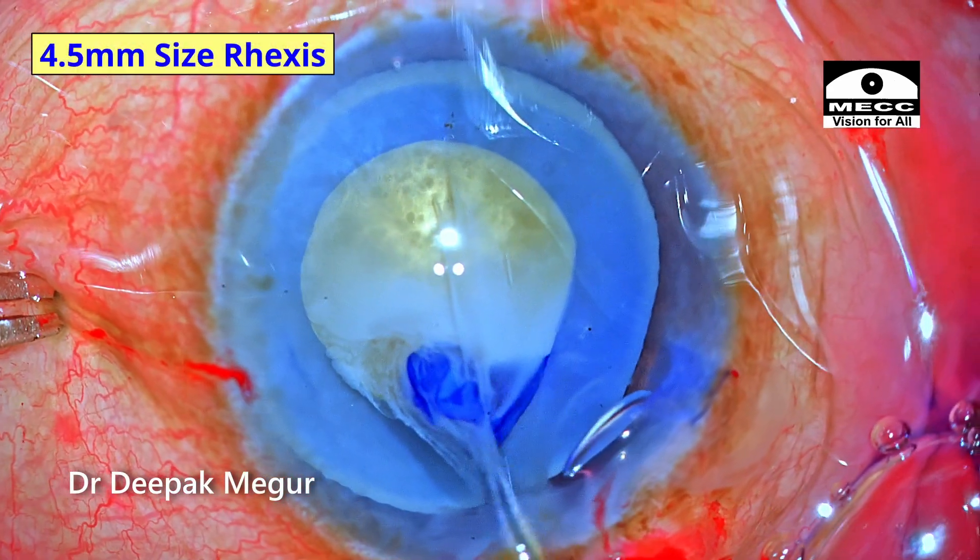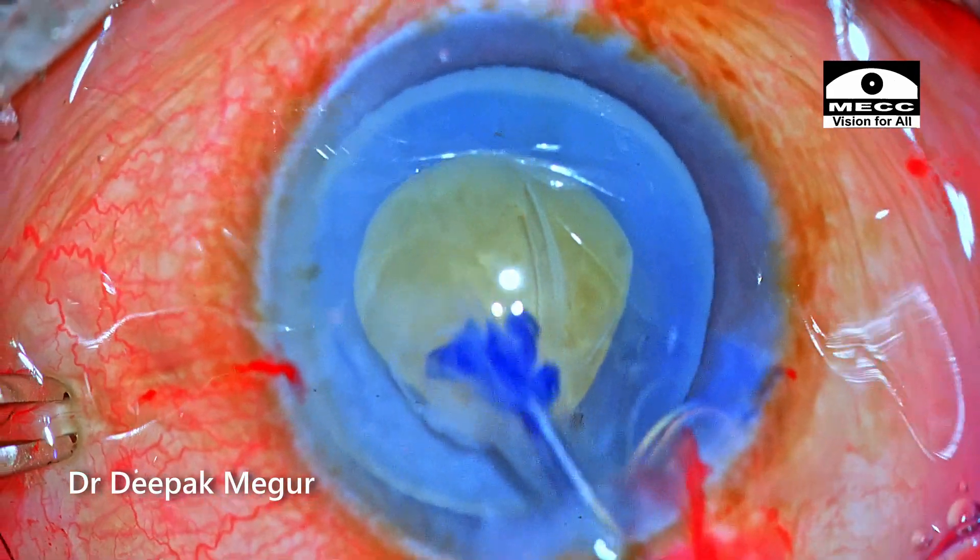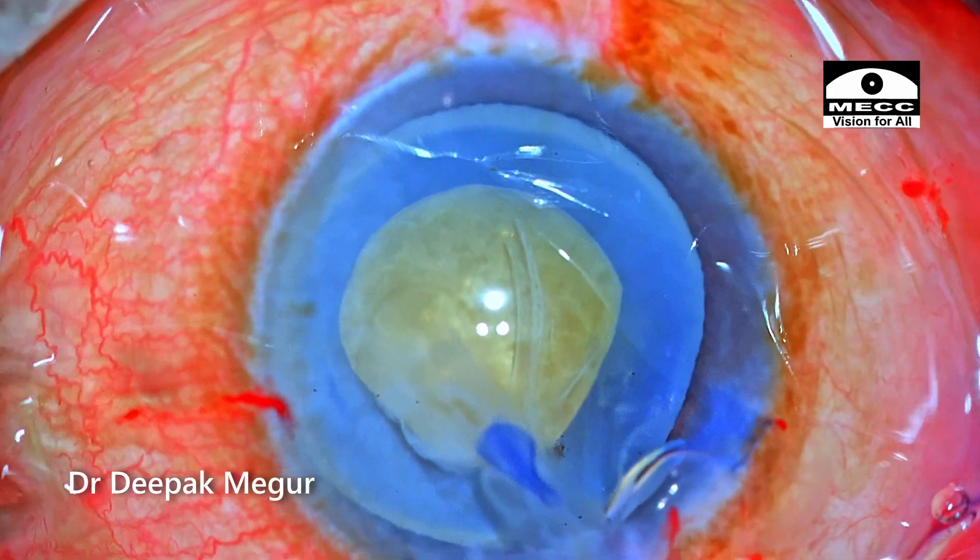I have a rhexis of about 4.5 millimeters. In the ideal world I would have liked a slightly bigger rhexis, but we need to manage with this size rhexis now.